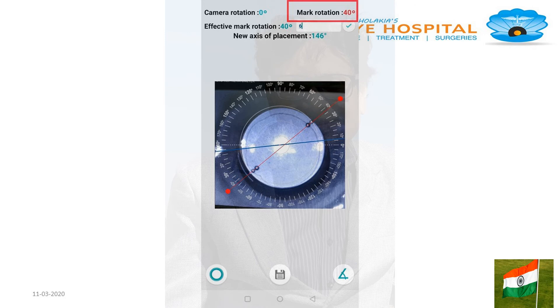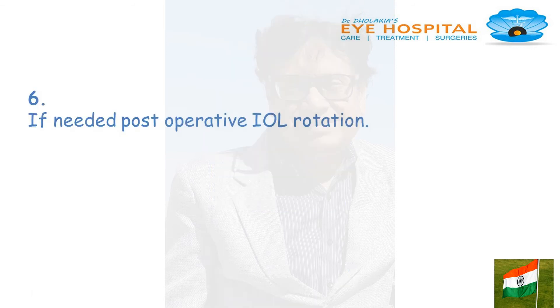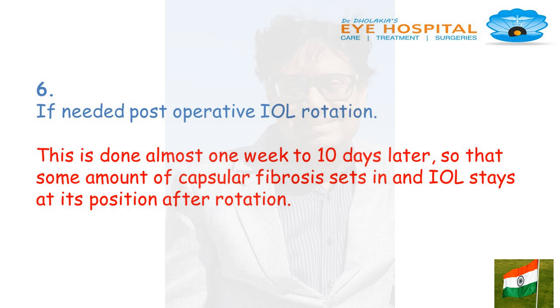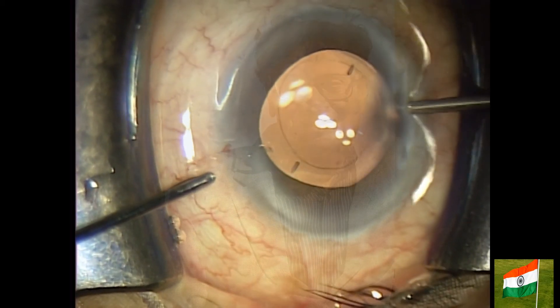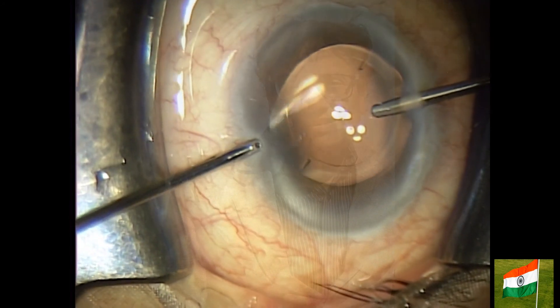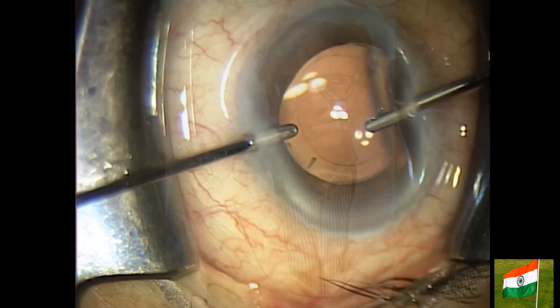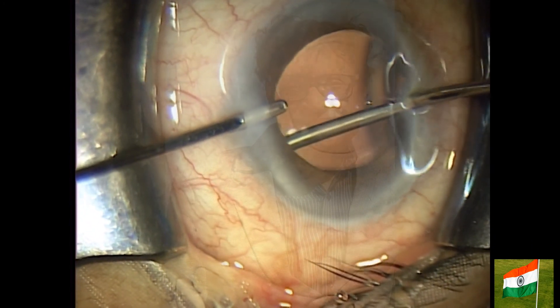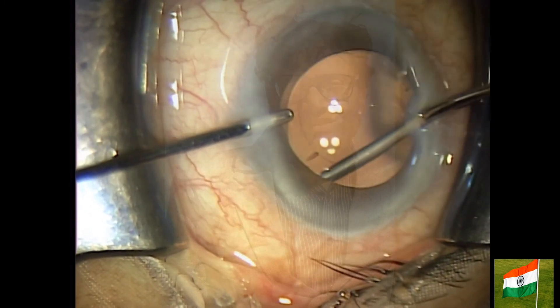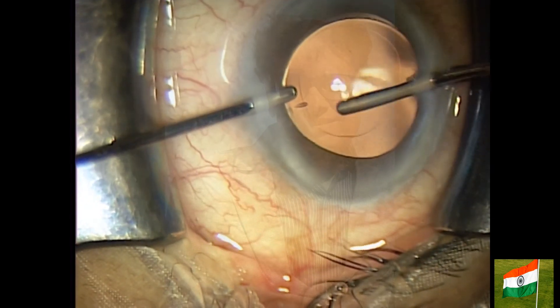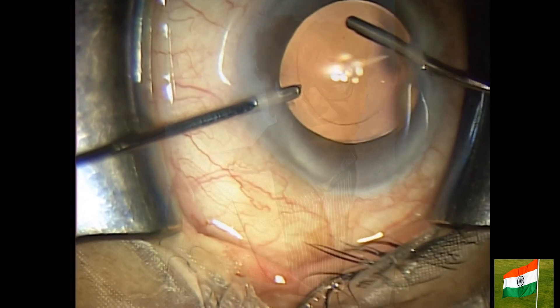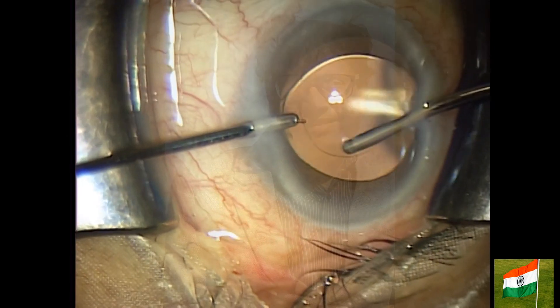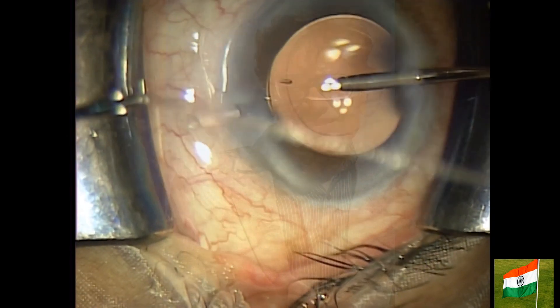Topic 6: In this patient, the IOL is rotated almost 30 degrees from its intended axis. If needed, post-operative IOL rotation is done — this is done almost one week to 10 days later so that some capsular fibrosis sets in and the IOL stays at its position after rotation. Post-operatively, I take the patient after 10 days. Bimanual irrigation-aspiration cannulas are inserted. With the irrigation cannula, I am separating the anterior capsule adhesion. Once the adhesions are a little free, I rotate the IOL to the target — here 90 degrees — using the two-dimensional technique again to finish the case.